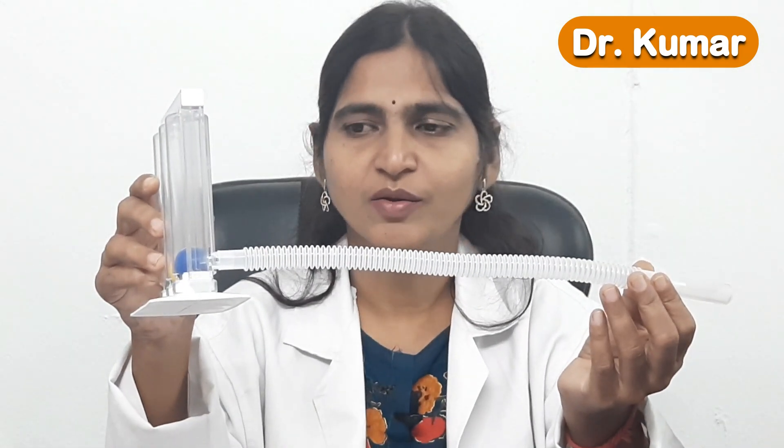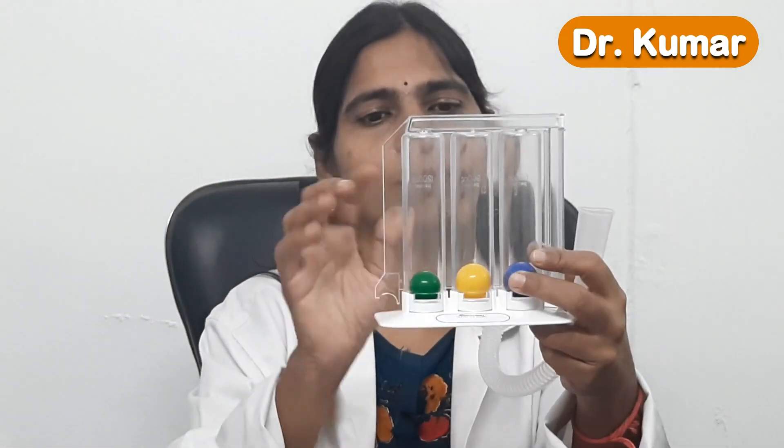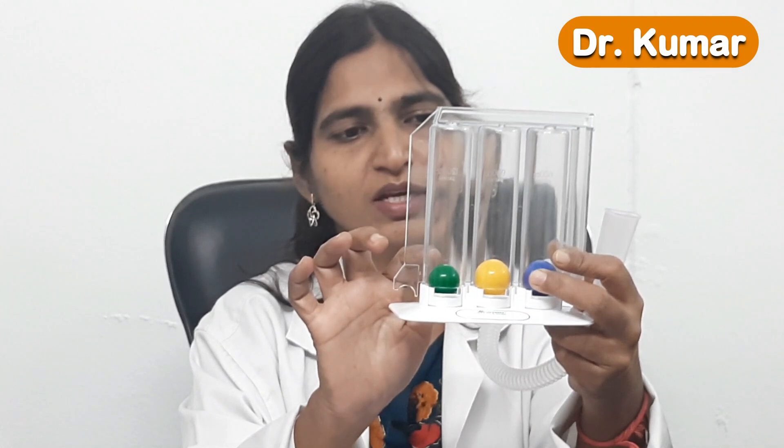This is an incentive spirometer where there is a mouthpiece and chambers with three balls. The movement of the balls depends on how much air you are taking in. As you increase the depth of breathing, the balls will rise in an orderly manner. First the blue ball will rise; if you breathe deeper or for longer, the yellow ball will also rise; and if the effort is more, all three balls will rise.